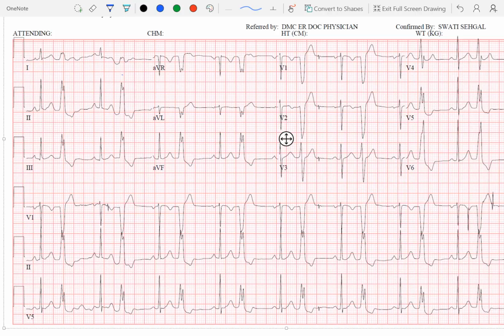Obviously, the resting ECG in the absence of PVC also gives a clue. You look at the QRS when the sinus beats conduct to the ventricle, and they look pretty normal. The QRSs are narrow, there is no baseline pathology, and the T waves are normal. There is nothing to suggest any depolarization or repolarization abnormalities of the QRS T wave segments. So the baseline ECG, when you don't have a PVC, is normal, and that's a good clue as well.